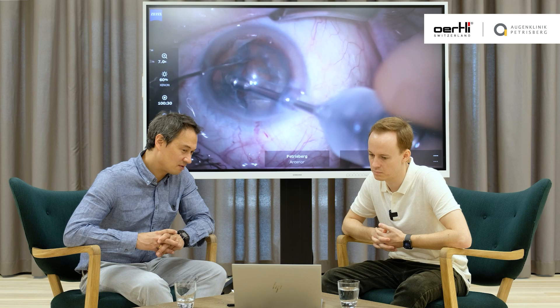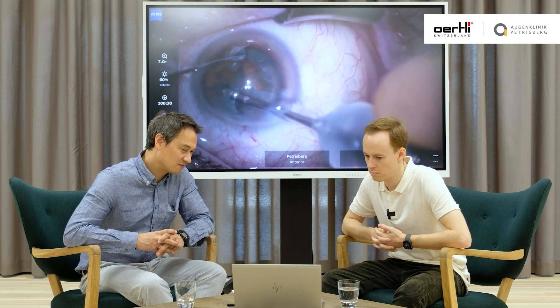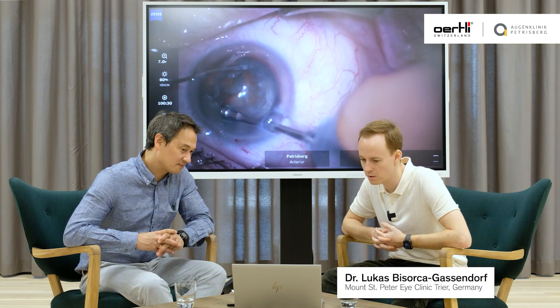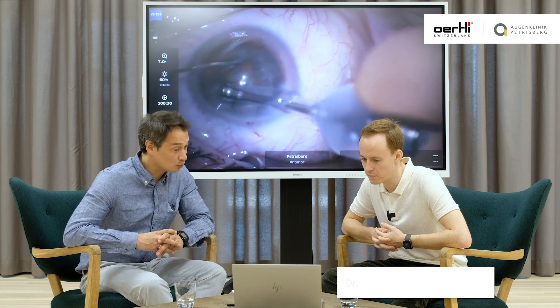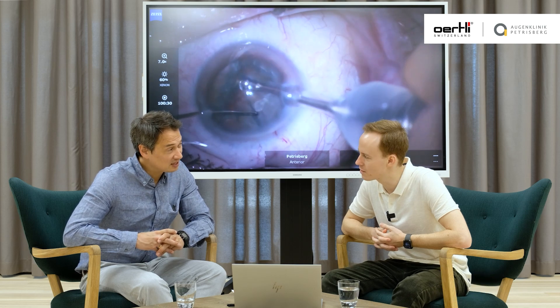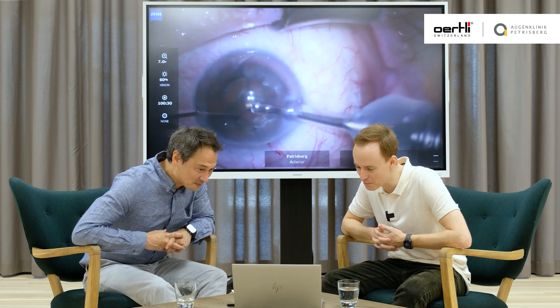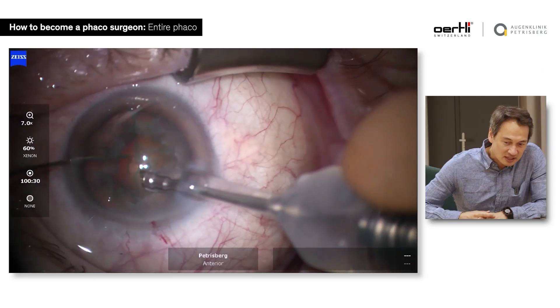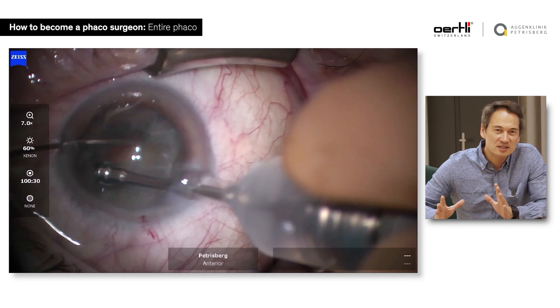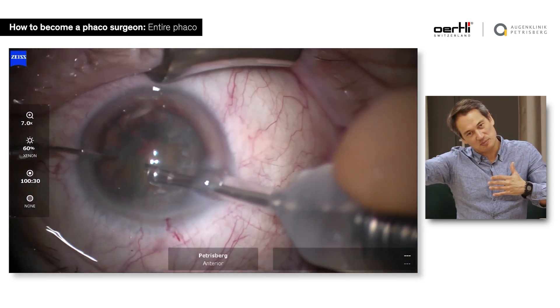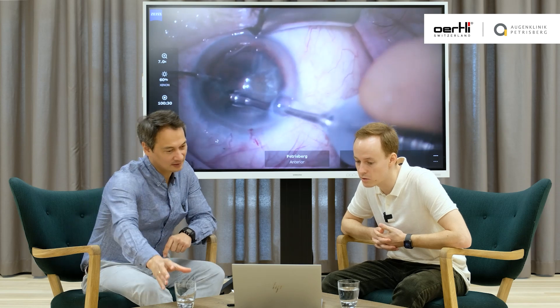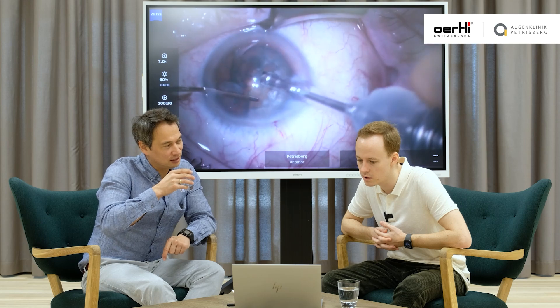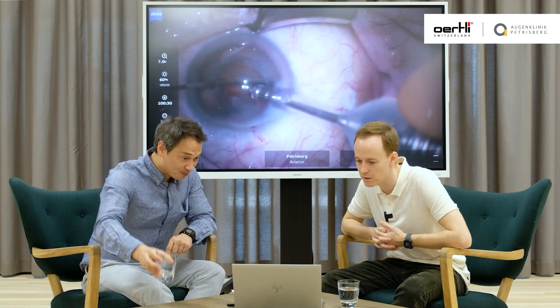Now I'm creating my first quadrant. Lucas, what do you think about the quadrants? It doesn't look like it's coming out easy. With the first quadrants, it's important to create lateral space absolutely, and as soon as you get the first quadrant out, everything usually goes smooth — unless you get into complications, which also tends to happen at this stage.